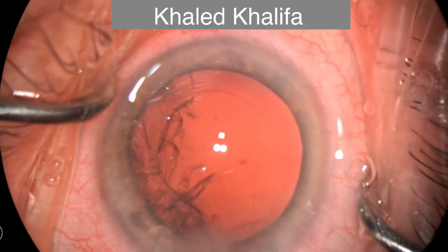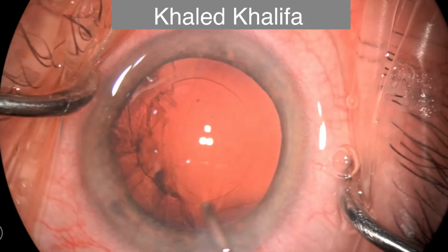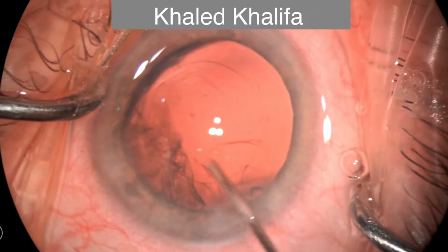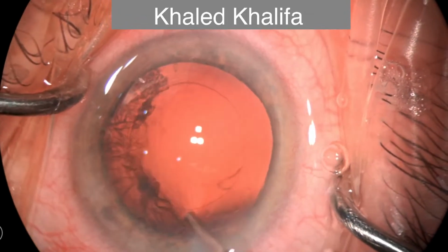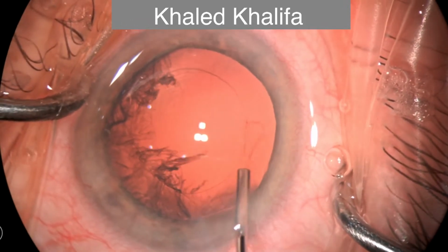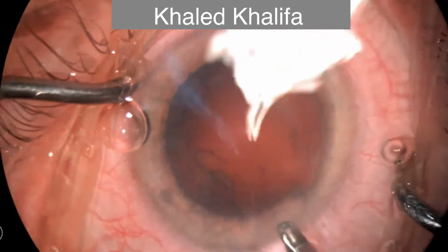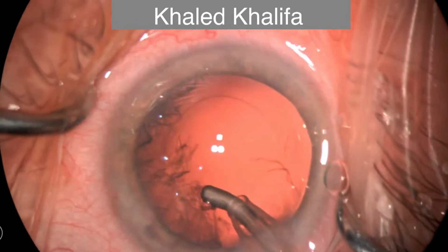with the IA aspiration cannula. I'm using a coaxial IA so that we'll go with the IA through the main incision, not a bimanual. I like the coaxial IA because it gives me the same flow inside the anterior chamber like the phaco handpiece.